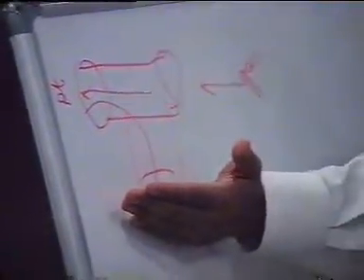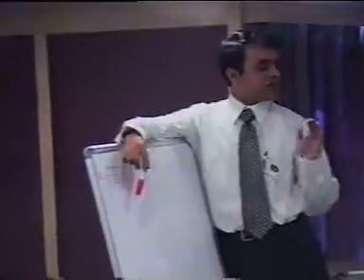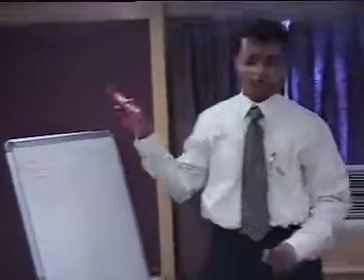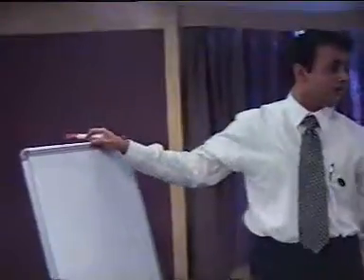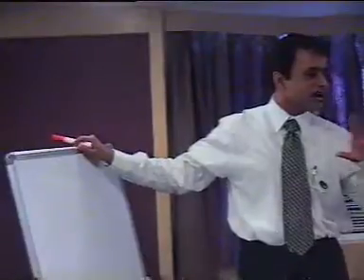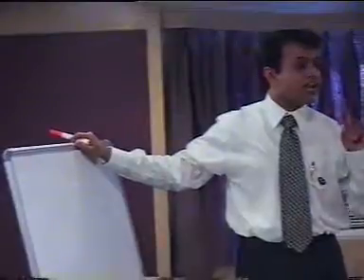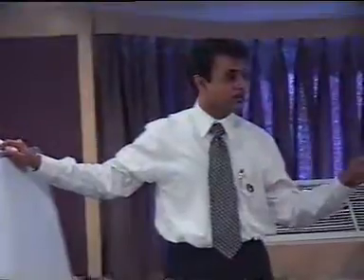But imagine if I occlude this end intermittently and the baby is not breathing. What happens? If I occlude, gas will go to the patient: inspiration. When I release it, expiration. So intermittent closure of this expiratory limb is what clicked in the brains of those old-timers, and they modified the Ayre's T-piece to make the conventional mechanical ventilator. You got this principle? The T-piece itself is not used in newborns at all because you have to attach it to the endotracheal tube, and we have realized that we are not going to intubate babies who are spontaneously breathing and not attached to a ventilator.